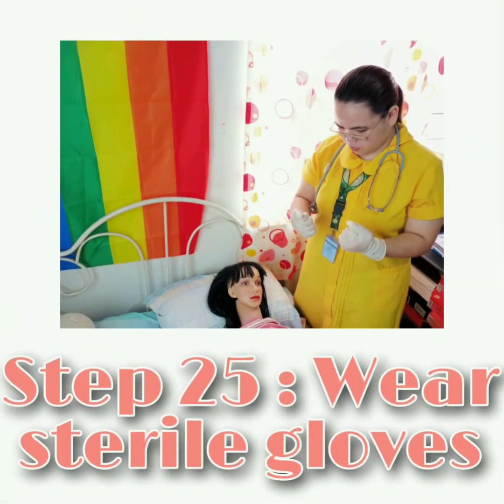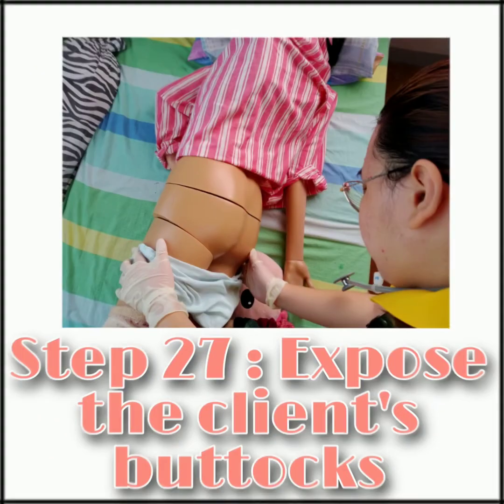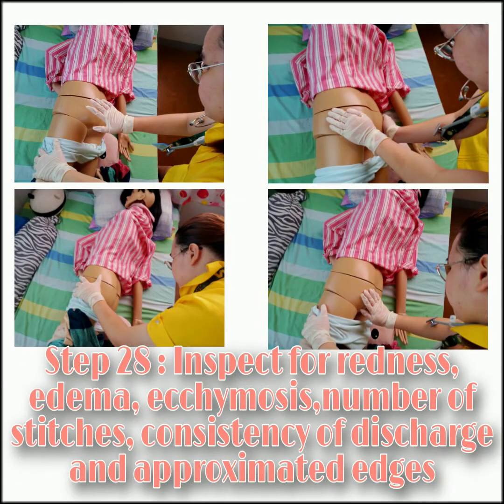Step 25. Wear sterile gloves. Step 26. Place the patient in lateral position with her back facing you. Step 27. Expose the client's buttocks. Step 28. Inspect for redness, edema, ecchymosis, number of stitches, consistency of discharge, and approximated edges.